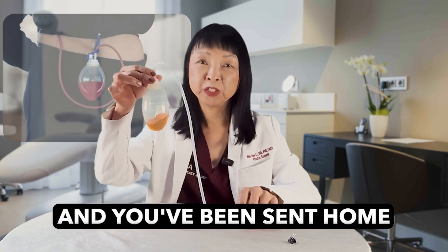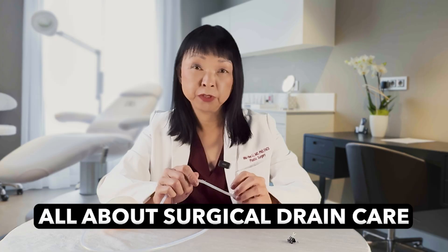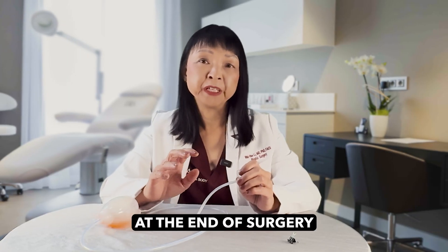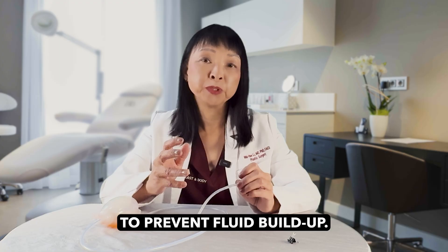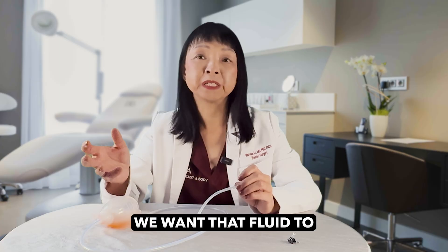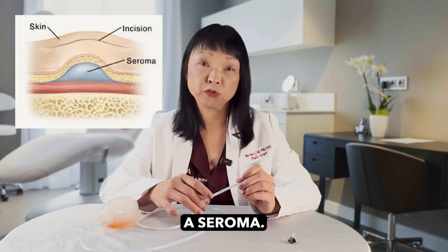If you've had surgery and you've been sent home with one of these, don't worry. I'm going to tell you all about surgical drain care in this video. Drains are basically put in at the end of surgery to prevent fluid buildup. When your body's had surgery, it's going to try and heal and it's going to make fluid. We want that fluid to come out. Otherwise, you get a fluid collection inside called a seroma.